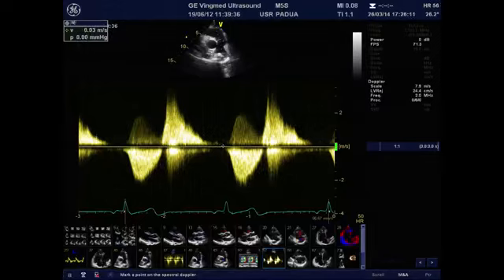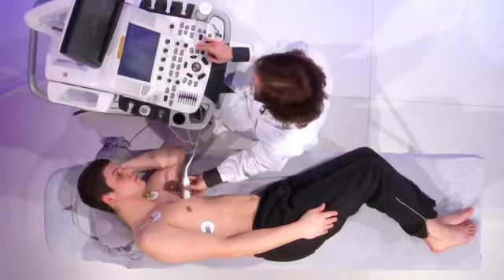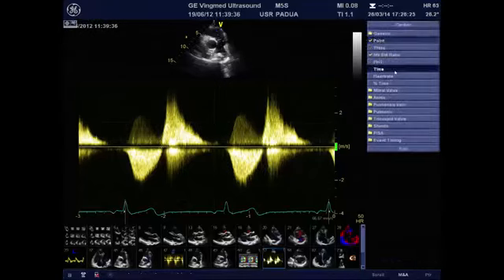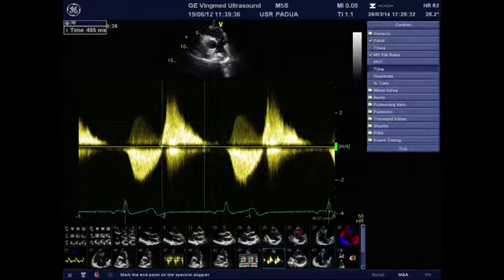And there is also the so-called PR index, the pulmonary regurgitation index, that can be measured by computing a ratio between the duration of the pulmonary regurgitation, like this, which is almost 500 milliseconds, and then you can take another duration to measure the entire duration of the diastole.